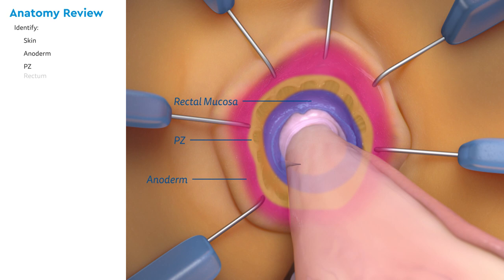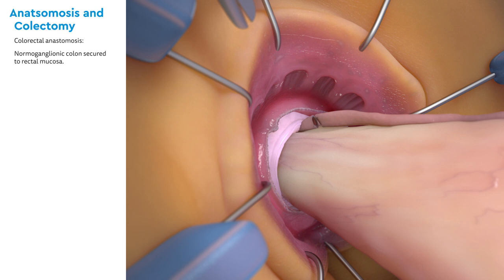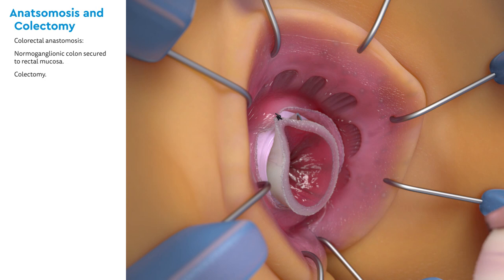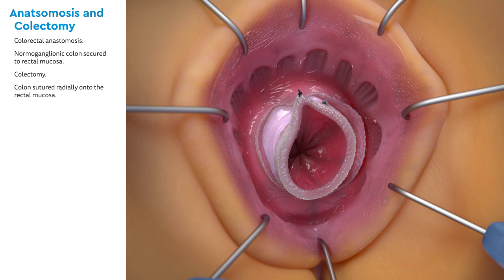In preparation for the anastomosis, identify the skin, anoderm, the pectinate zone, and the rectum. To begin the colorectal anastomosis, the normal ganglionic colon is secured to the rectal mucosa with a full thickness stitch. Next, the colectomy is performed, the specimen is removed, and sent to pathology. The colon is sutured circumferentially onto the rectal mucosa. Note the diagram to the left. Because it is usually an asymmetric anastomosis, it is essential to take care to match the two different sizes of the lumen evenly.